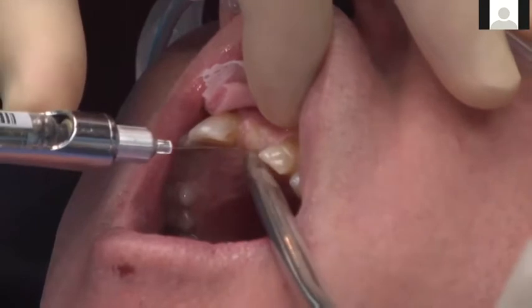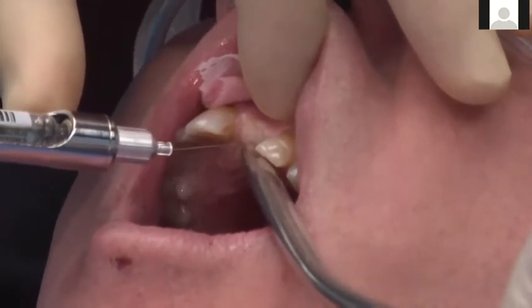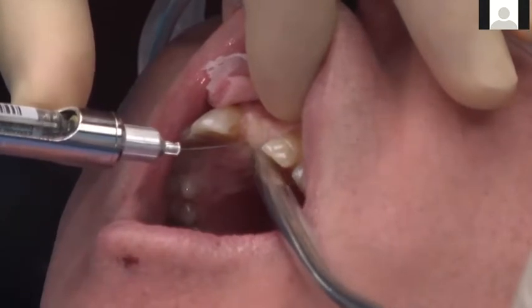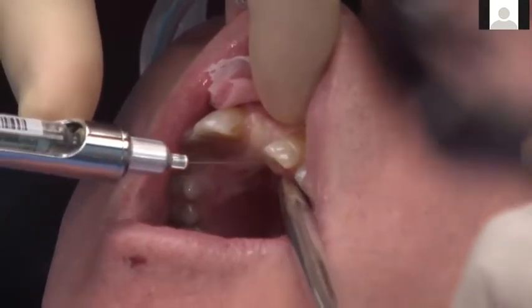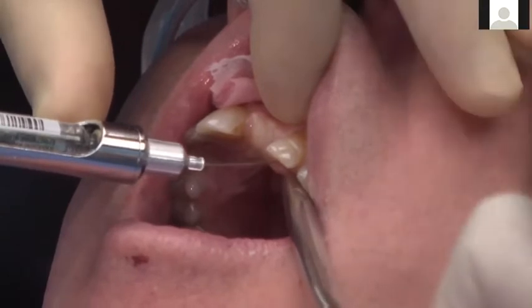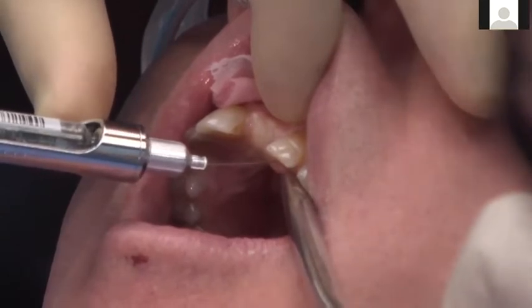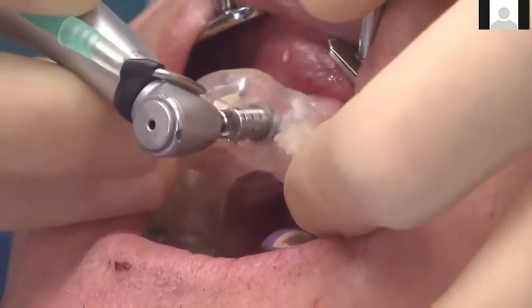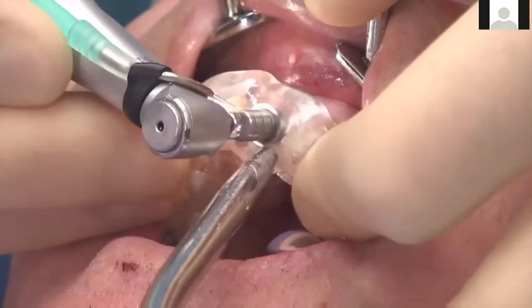Here we are just going into the incisive canal and anesthetizing the incisive neurovascular bundle in this area, after we have done the buccal, obviously, and then a little bit more on the palatal side of this site. Again, just small injections.